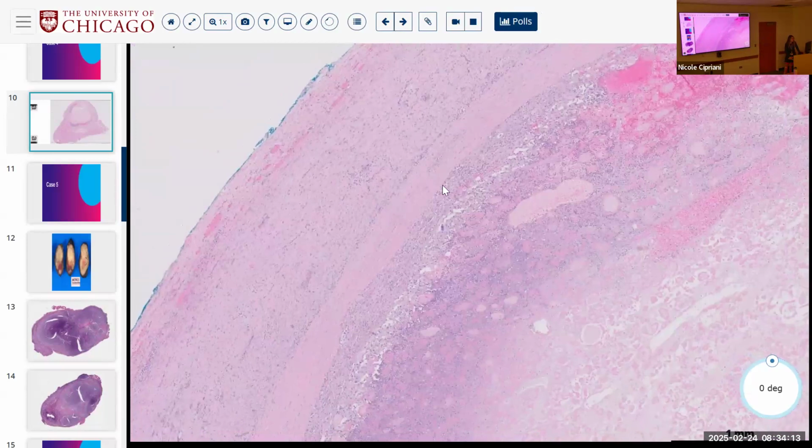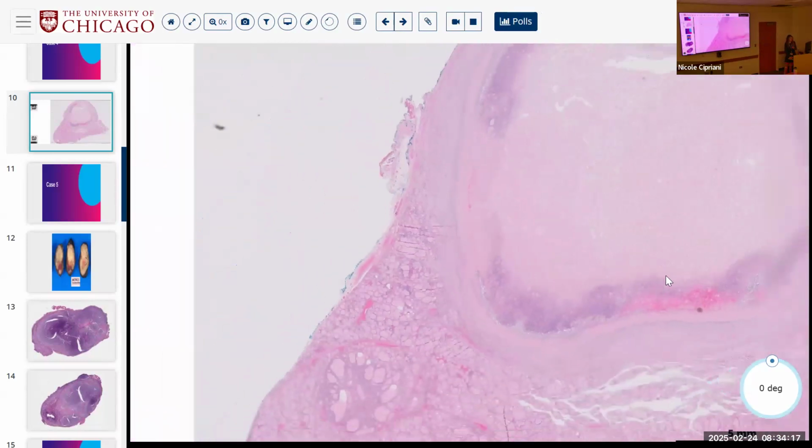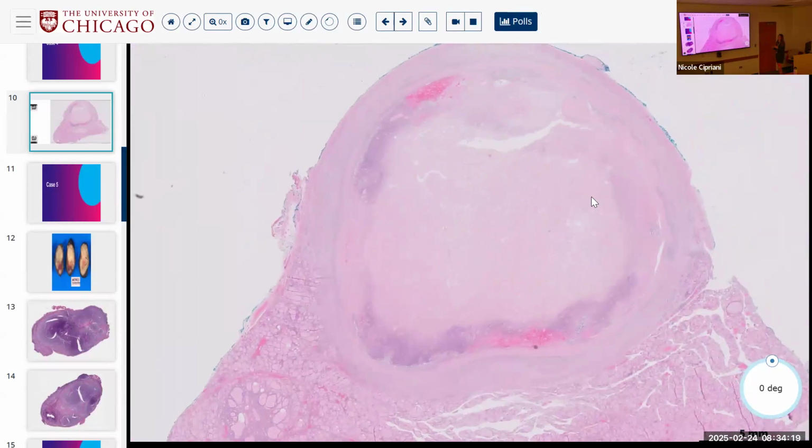And as long as you don't see any oncocytic anything outside of the capsule, you can probably safely assume that this probably was benign, but it can be really, really hard to say. So sometimes I just call these infarcted follicular neoplasm. See comment. Like, I see a capsule, I don't see any definitive invasion, but it's all dead. So maybe it probably was an oncocytic adenoma.